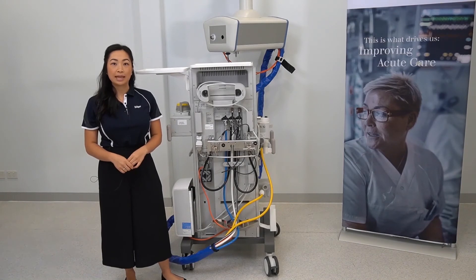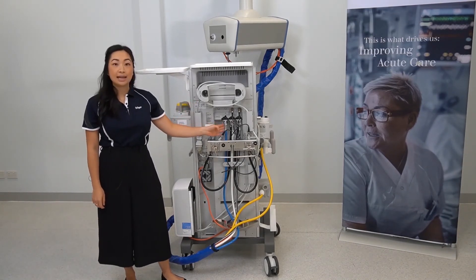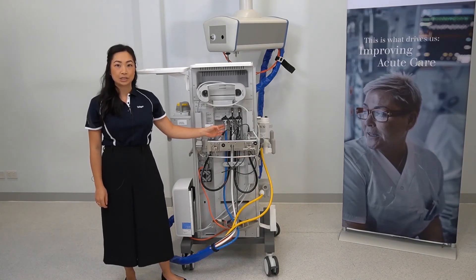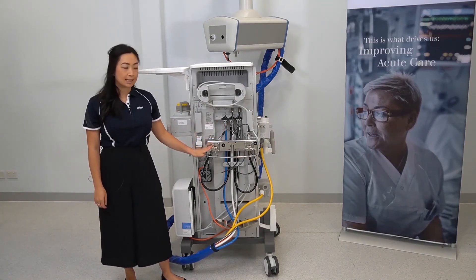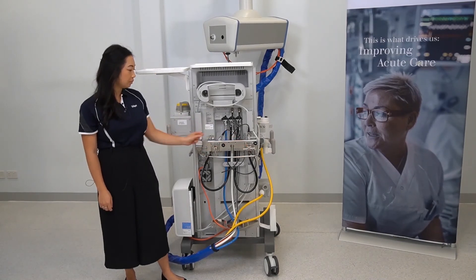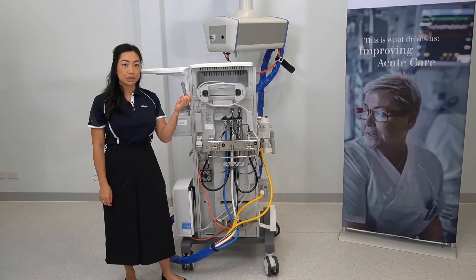Now we are looking at the back of the ATLAN A350. Located here are the hoses to connect to the central gas supply system. You can mount your reserve gas cylinders here. Attached to the device is a wrench for opening certain cylinders.